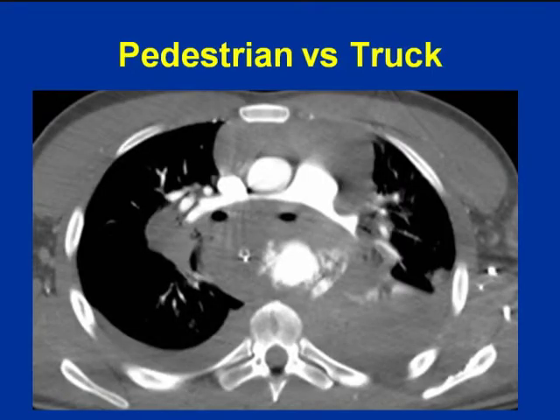I start with this case. This case actually came to me the week following my acceptance of this talk to this conference. I thought it was very timely. This is a young patient, 18-year-old, with an initial psychotic break who was playing tag on Interstate 95 South and unfortunately got tagged by a truck.